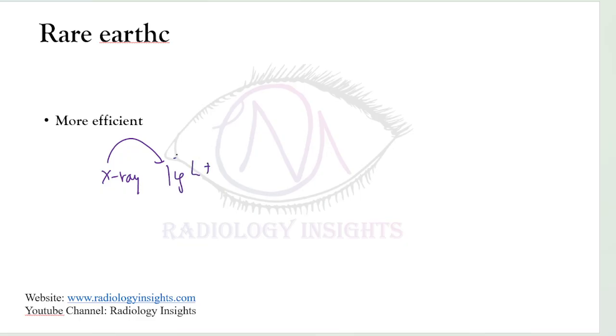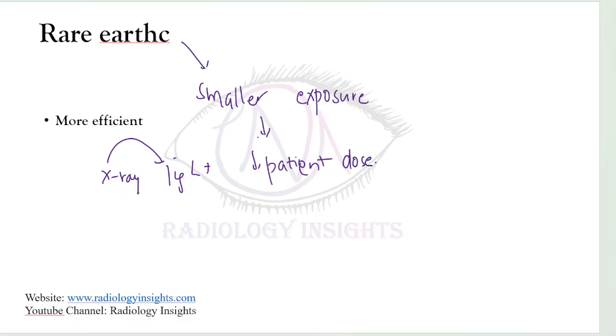Two factors together make rare earth screens more sensitive than calcium tungstate screens: the rare earth requires a smaller exposure for conversion of the same amount of X-rays into light, and this smaller exposure results in a reduction in patient dose by 2 to 3 times while producing the same quality of image.